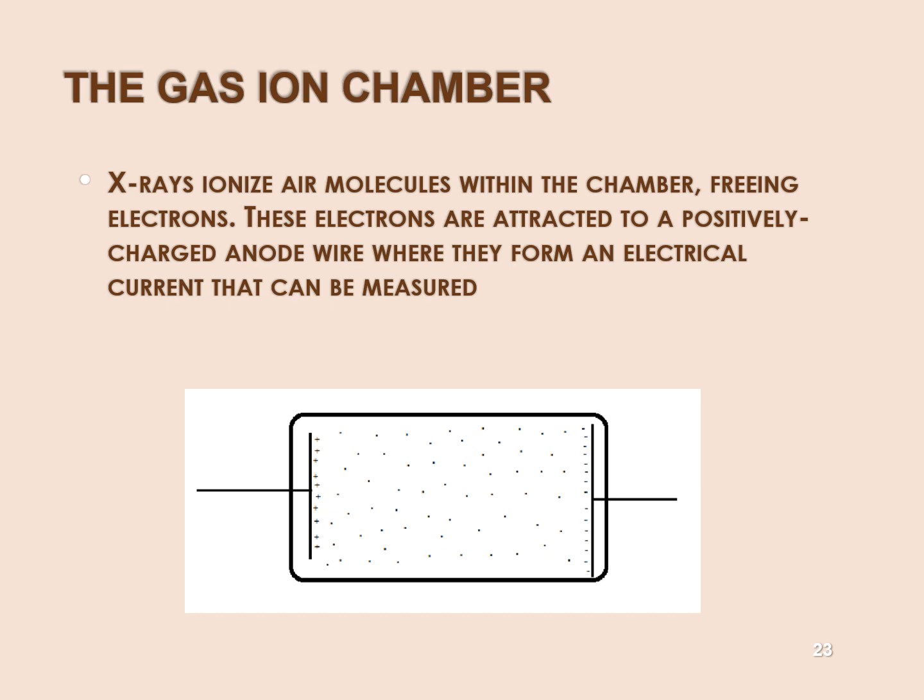But it's called AEC, and some people call it an automatic timer. Remember, photo timer? It's not a time-keeping device at all. It's a radiation threshold device, is what it is, okay? And that's critical to your understanding of it. It builds up a certain amount of ionizations in that trapped pocket of gas, and when it reaches a certain threshold of ionizations, then the conditions are right for conducting electricity, and you get an arc that flies across the ion chamber. And then the circuit is connected, and then you shut off the X-ray exposure, okay?